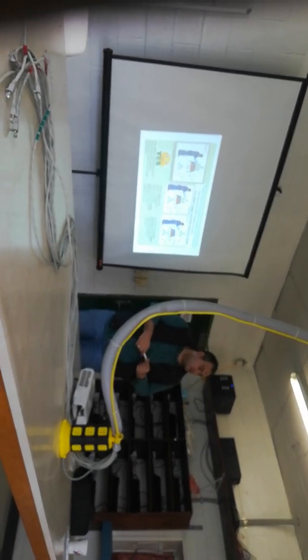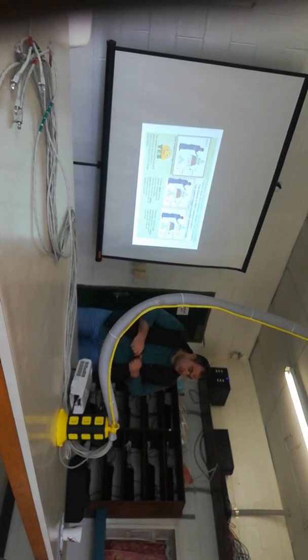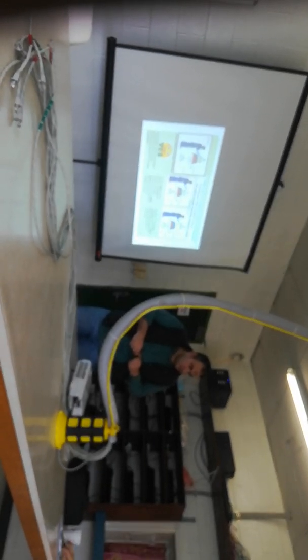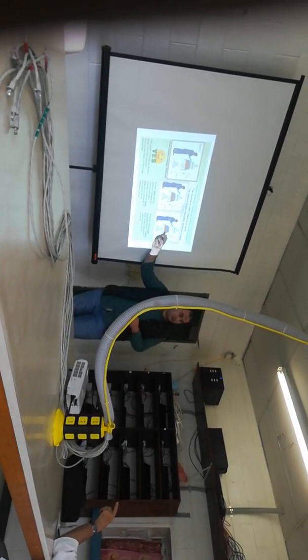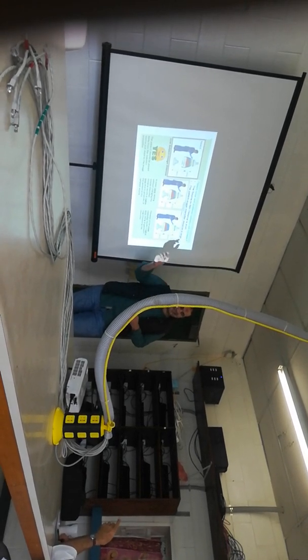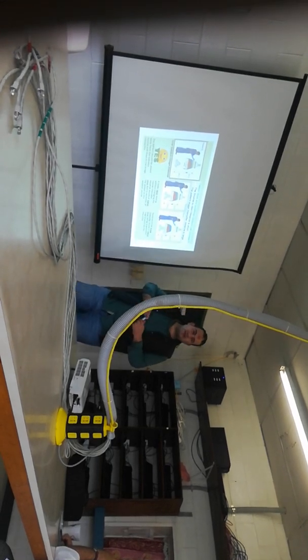But why is the extension of the distance between the patient and the image intensifier so important? I don't understand this one. Because it multiplies the dose. Why, when we increase this distance, does the dose increase? Good question.